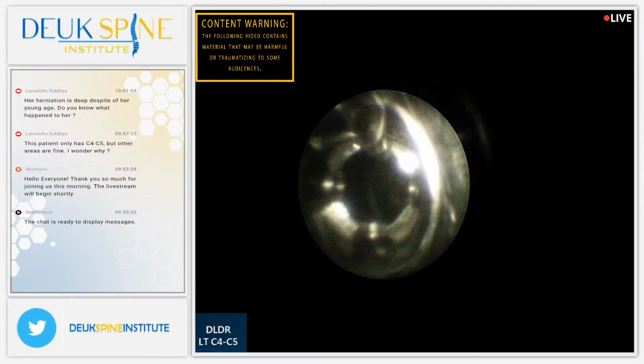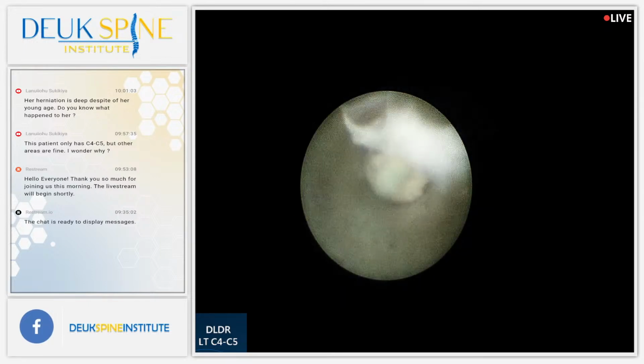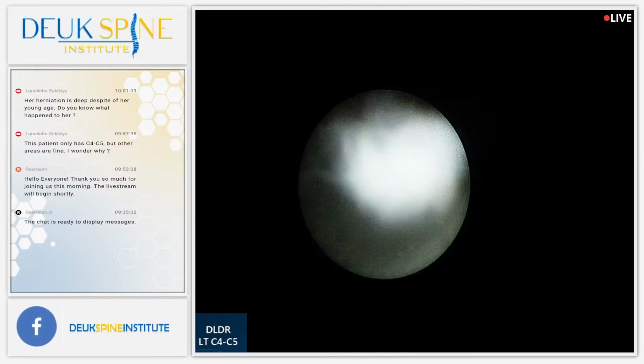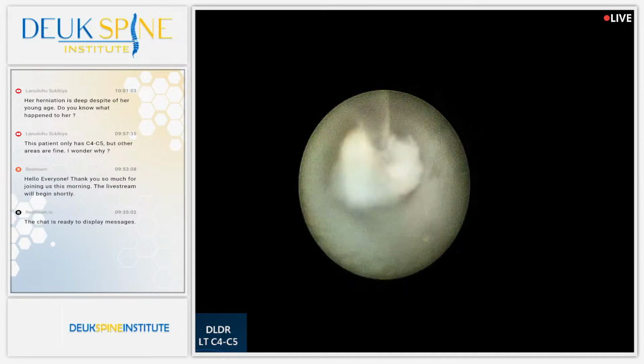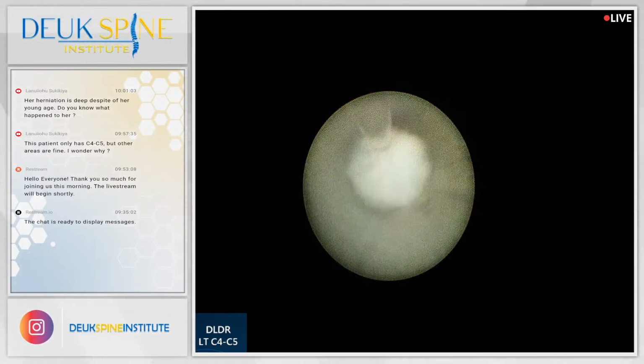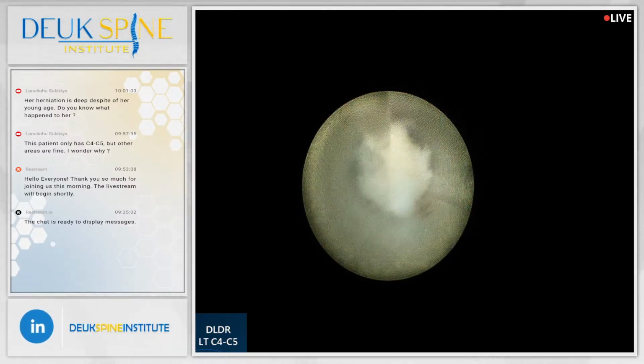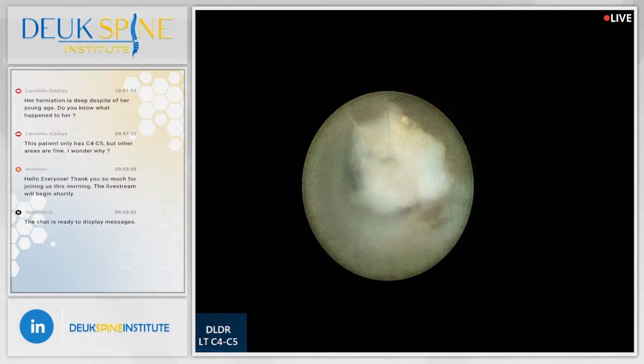So we have a lot of people that don't like us because they don't do the surgery and they don't benefit. But patients benefit because the patient doesn't have to have metal put in their neck. I'm not getting much from the laser, I don't think. Maybe 20?